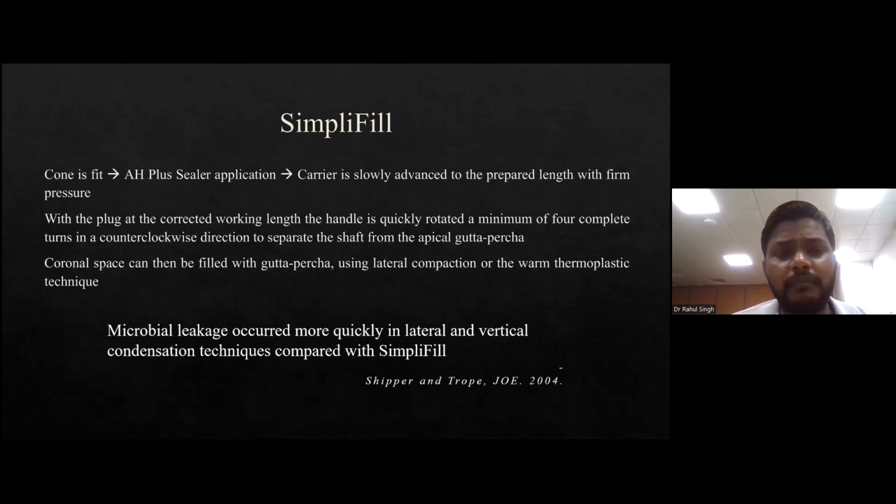And the only barrier that you can see, Simplifill is a very good technique, but the only barrier is if you have these instruments, first the LightSpeed instrument, and also the ability to retreat in such an obturation system is really difficult.